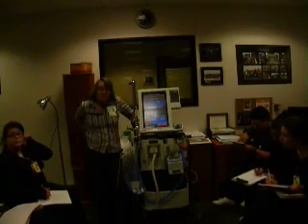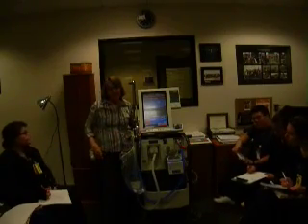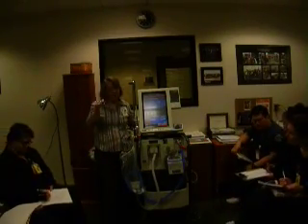Yes. I'm sorry, you said the ideal body weight, we don't have to have it for the ventilator? Well, we have to have the ideal body weight, but we don't use the setting on the ideal body weight on the ventilator. So you just touch it and hit continue.